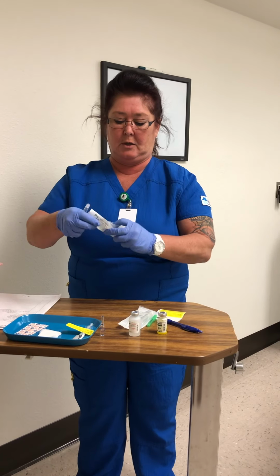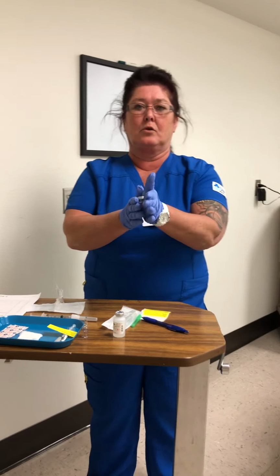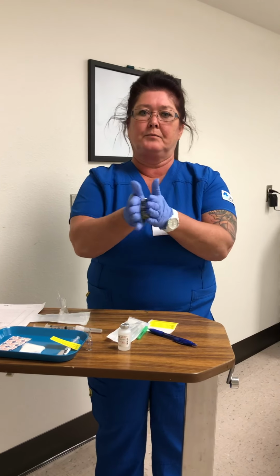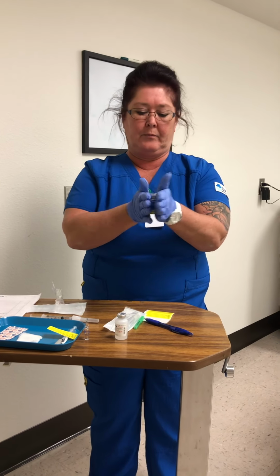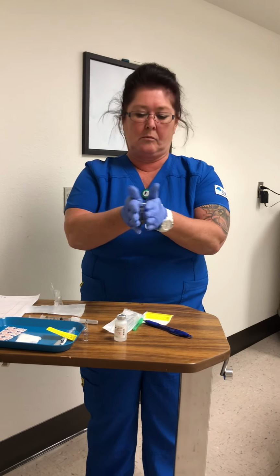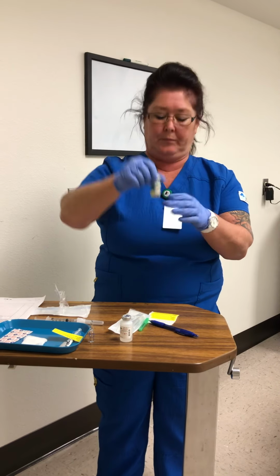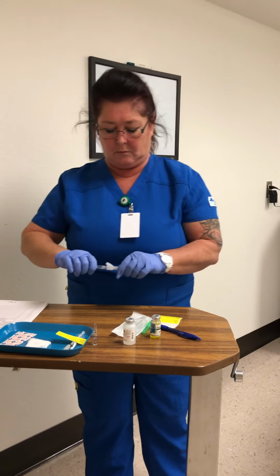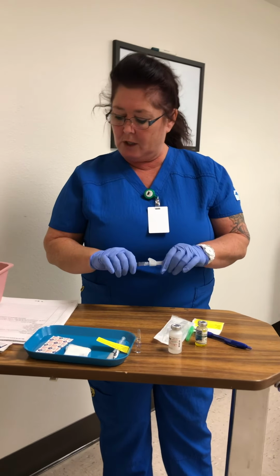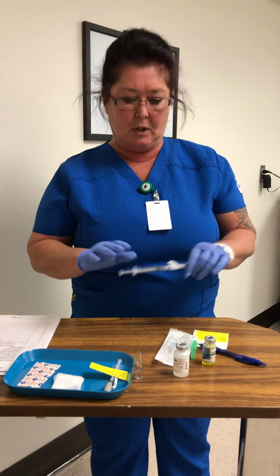I am going to attach the injection needle, and then I'm going to again gently roll between my hands to make sure that the powder is completely mixed. Again, checking the color, making sure that it's what it should be. So for this injection, we are doing 1 milliliter, which I have determined after doing my dimensional analysis.